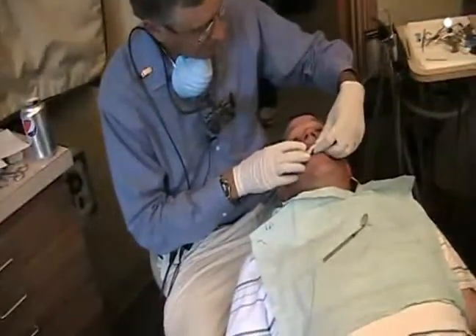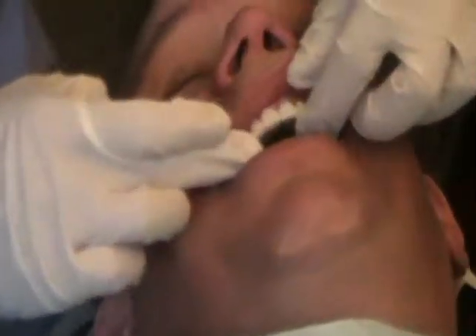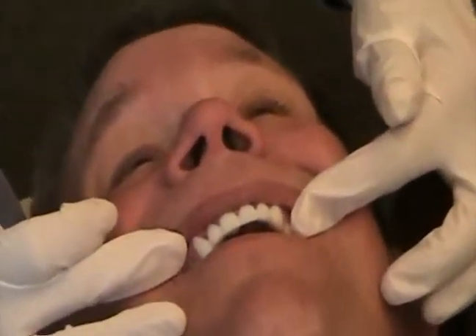David, open for me a little bit and we'll try that in. Let's go ahead and focus in on that and we'll go ahead and see how that is.